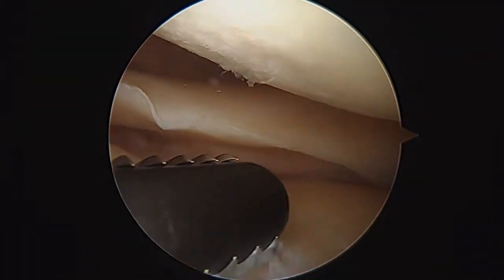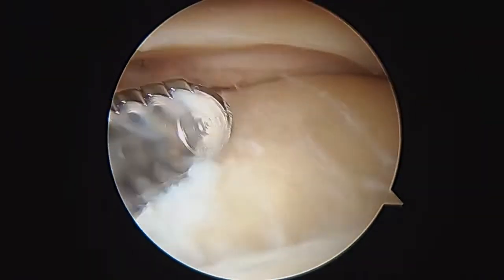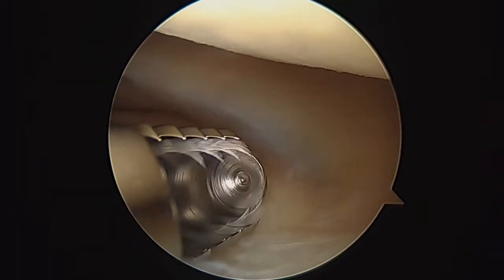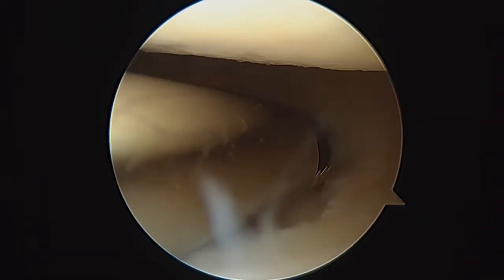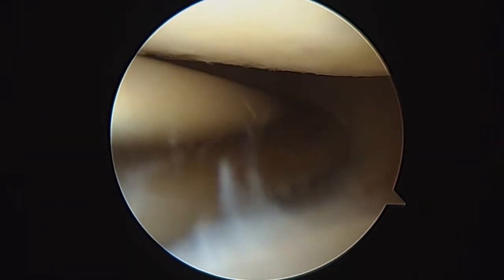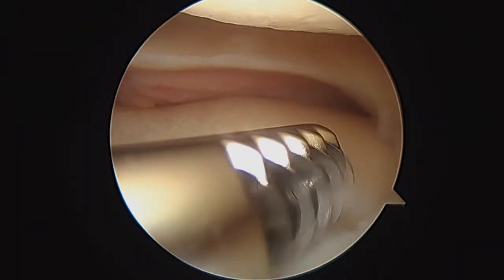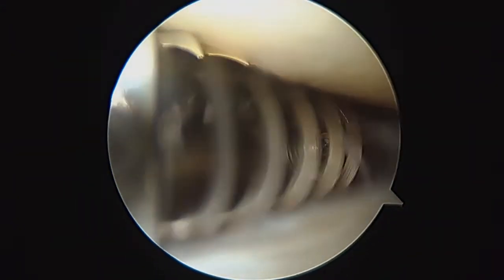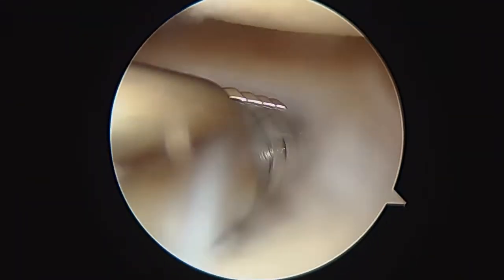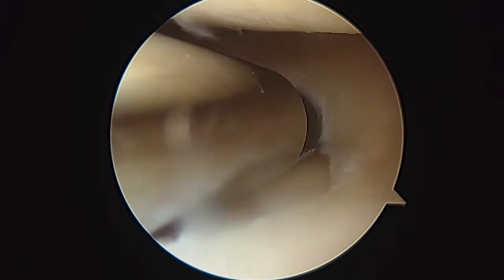Here's our look inside the lateral compartment. The posterior horn of the lateral meniscus looks good. You've definitely got some arthritis on the tibial plateau — you can see these areas here. You had a little bit of a tear right here in the lateral meniscus. It's more of a radial tear, not a repairable tear — just something we can trim out pretty quickly to smooth out the inner edge. Once we get that little part, we're going to look in the patellofemoral compartment next.